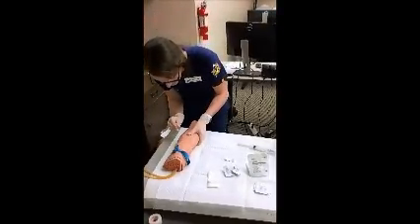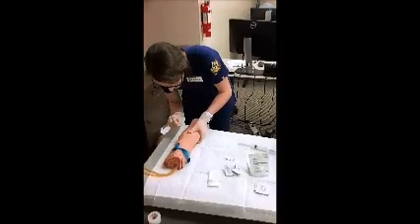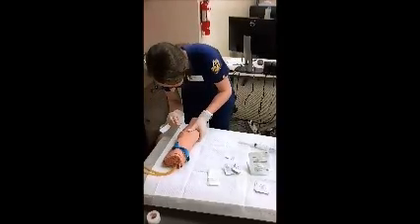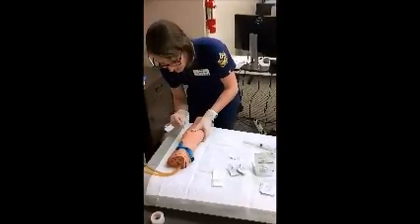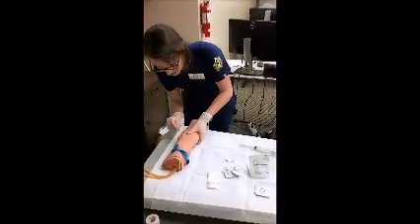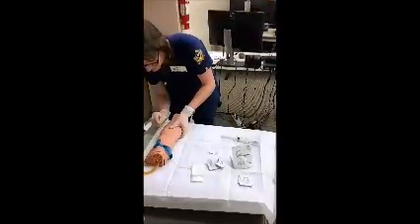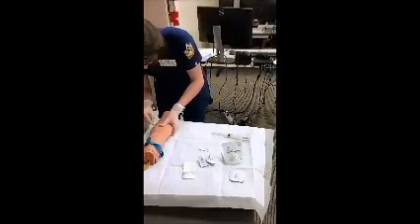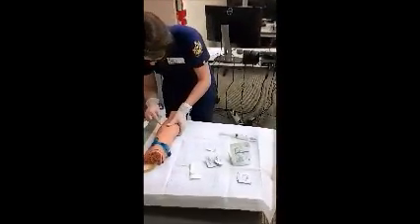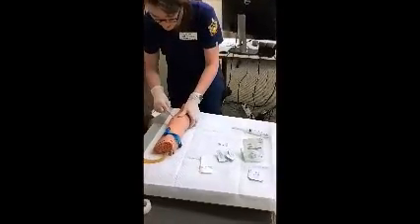Tell the patient to take a nice deep breath in and relax as much as they can. Just be a quick poke. And once we get in there, we'll see flash. Once we see flash, we stop advancing the needle and advance the catheter. Pull that back until you hear a click. Advance the catheter all the way.